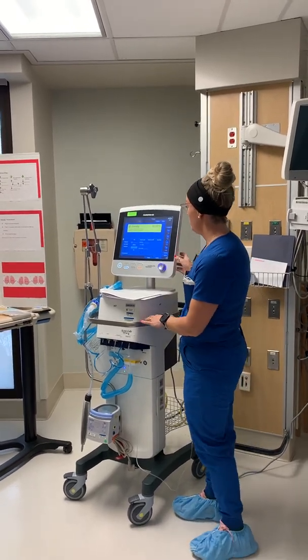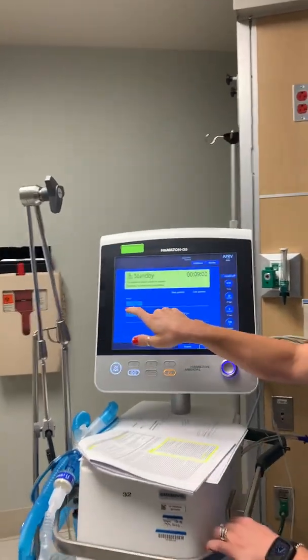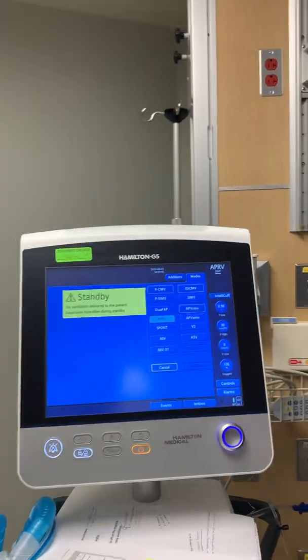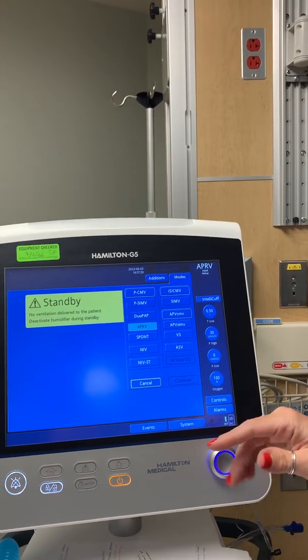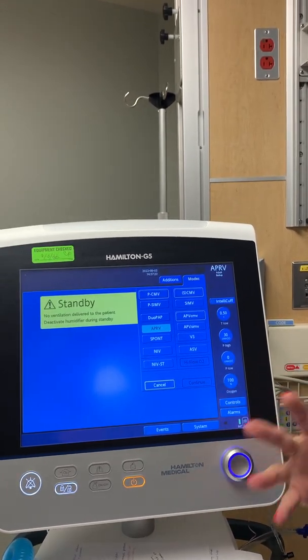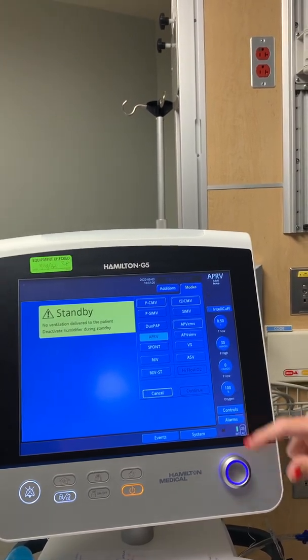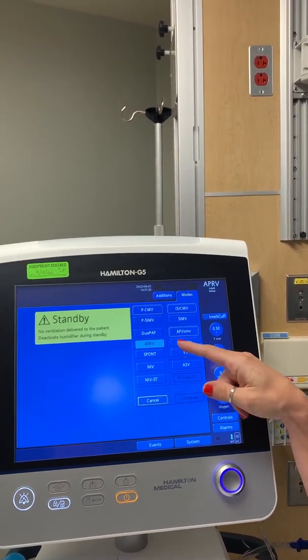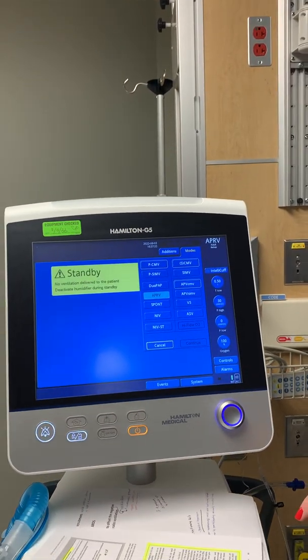On the new ventilators, when you go to modes you're used to seeing Duopap and Duopap Plus. We want to choose APRV every time. If APRV is not available, choose Duopap Plus, because Duopap does not give all the correct settings that you want to dial in.